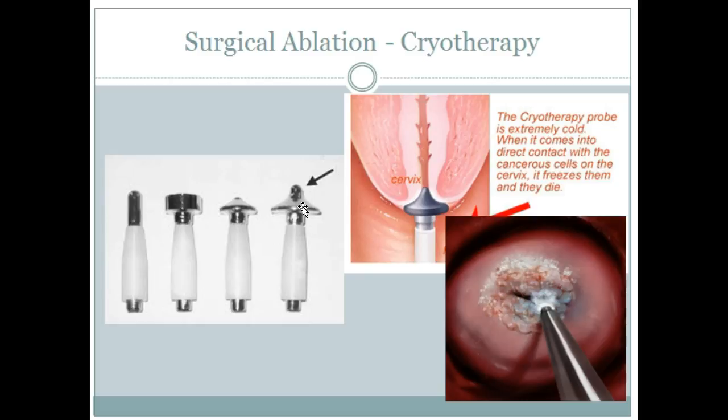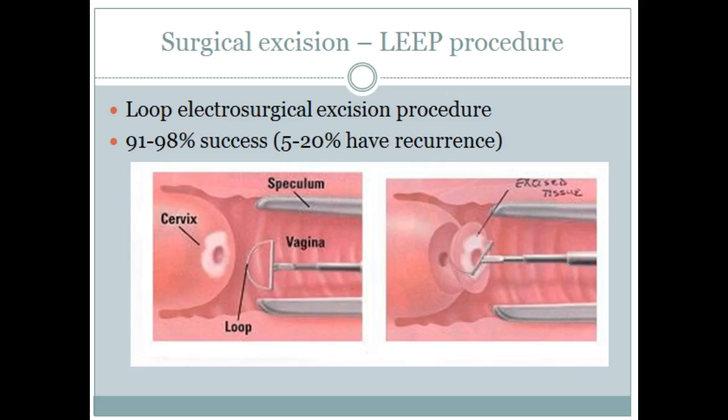So it can be hard if it's too large a region that's abnormal, but again, just pick the best instrument that makes sense for what you're seeing. Women who have this done typically will have a watery discharge for around 6 weeks as those cells continue to shed and die, so that's kind of helpful for them to know as well.